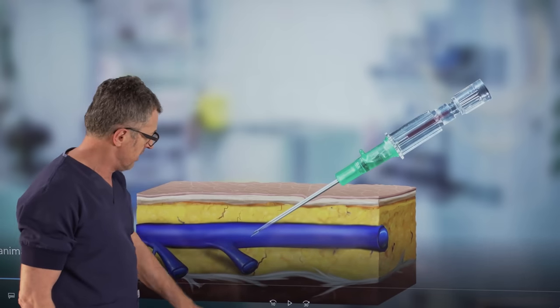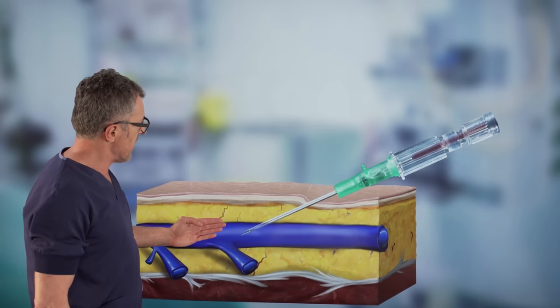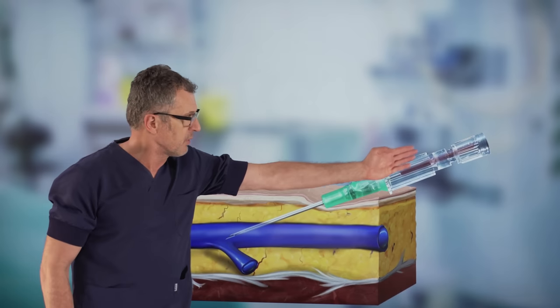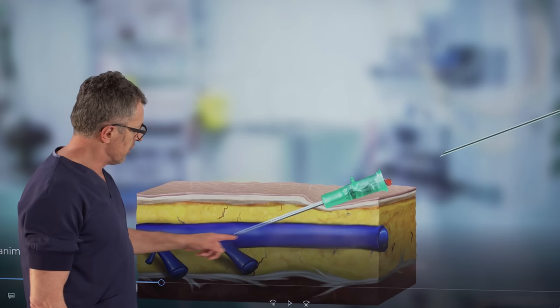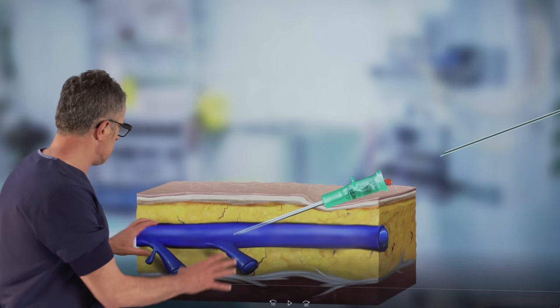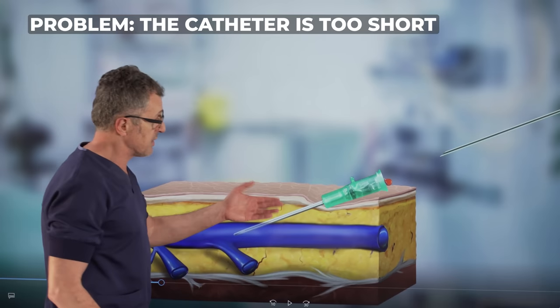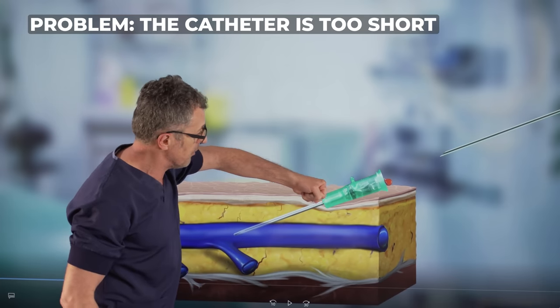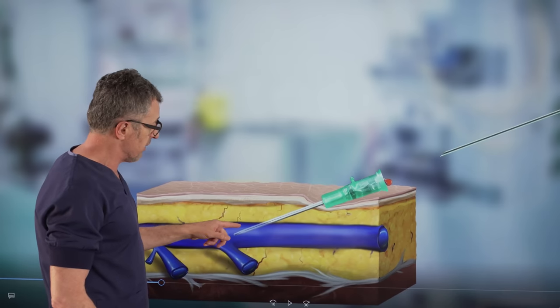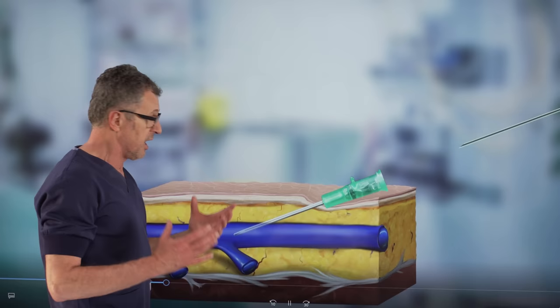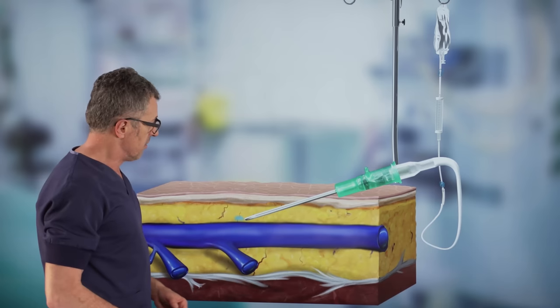As soon as the catheter enters the vein, we will immediately see the flashback, as we call it, because the blood will want to go into the expansion chamber. And there it is. So now we know that we're inside the vein. And at this point in time, what we simply do is continue advancing the catheter, lowering the angle, and pull the needle out, leaving the catheter inside. But again, if you can take a look at this image, you can see how very little of the catheter is inside the vein to make it stable.